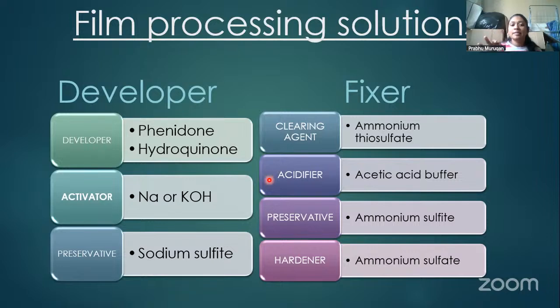The X-ray film has been developed now. Next thing, what you have to do is dip it into the water, basically to remove the excess developer. Okay, you're going to dip it into the water and then dip it into the fixer solution.